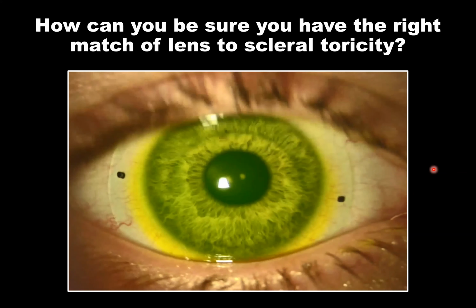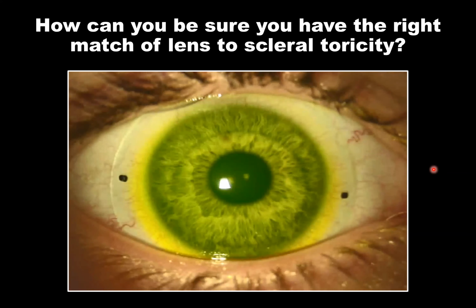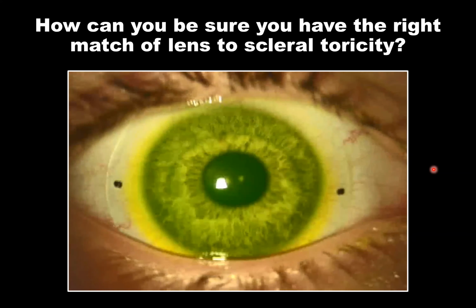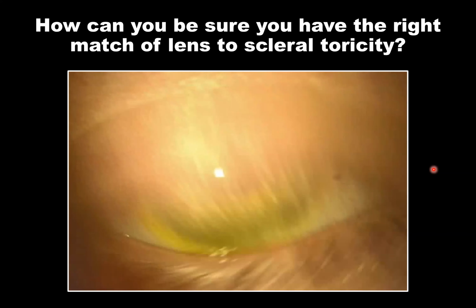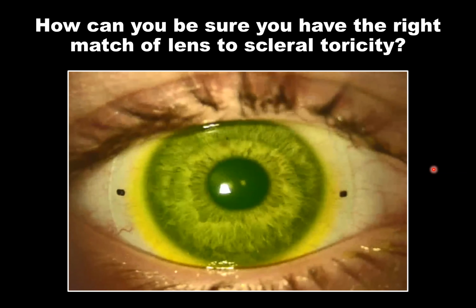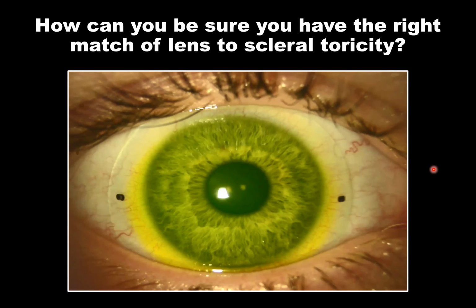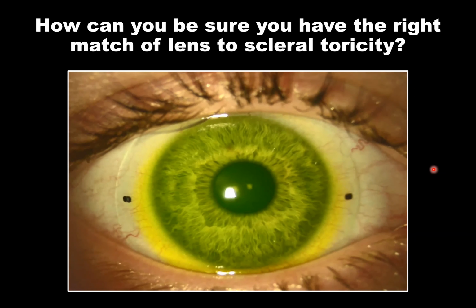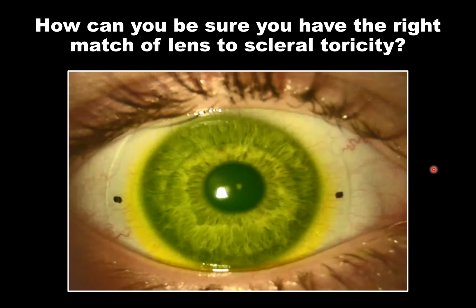In other words, the toricity of the lens is matching the toricity of the conjunctival surface it's landing on. And this is important because it creates a more appropriate landing on the sclera, and it also helps when you need a front toric lens, which we'll discuss shortly.